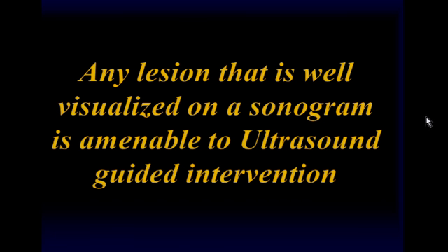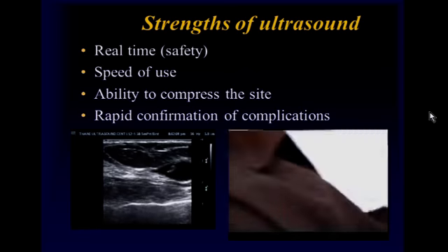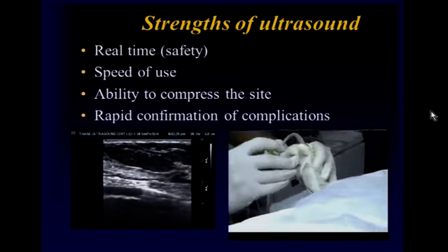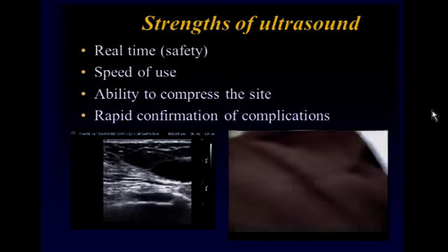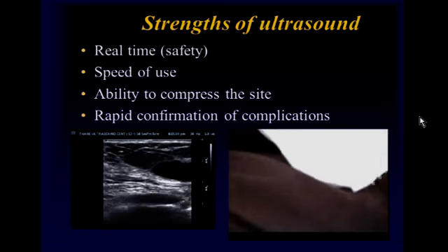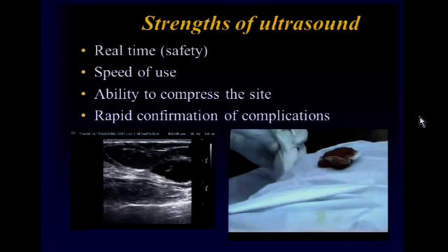Ultrasound has several strengths. It's the only real-time technology and therefore it is safe. It's got speed because you are seeing things in real time. As soon as the needle comes out, one can compress the site of puncture, and if there are any complications, they can be picked up very easily. Here, for example, we are aspirating a breast cyst, and before the patient knows about it, the fluid is out.